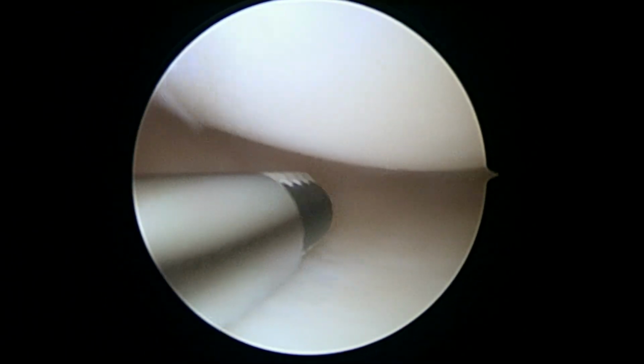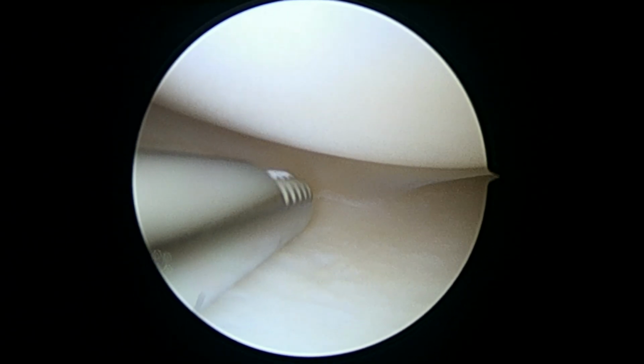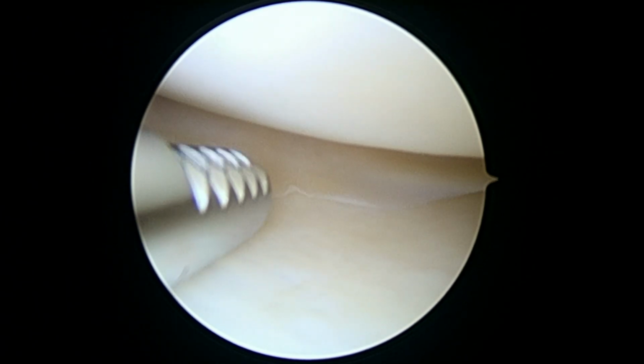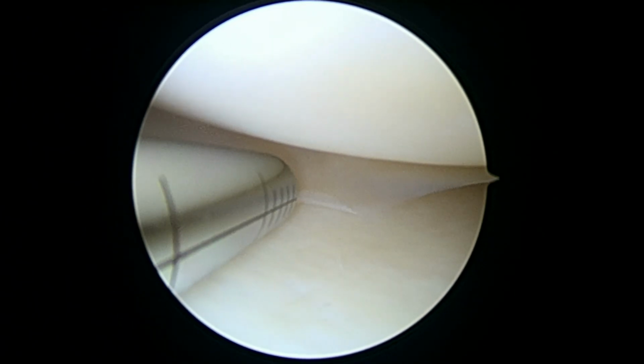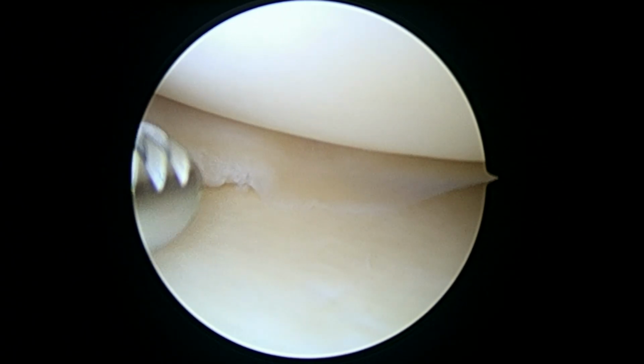Meniscus looks like it's in good shape. The cartilage above looks good. Maybe some minimal fraying right in here. But as you can see, pretty easily handled with our shaver. Don't even need a pair of scissors for that. And now we'll go off on the video and show you some more in just a minute.